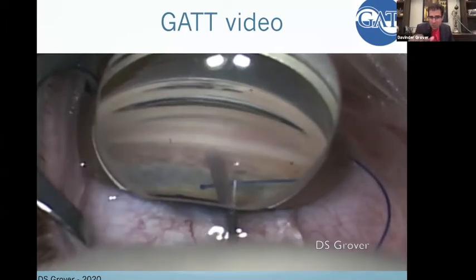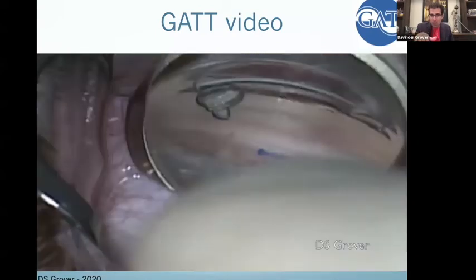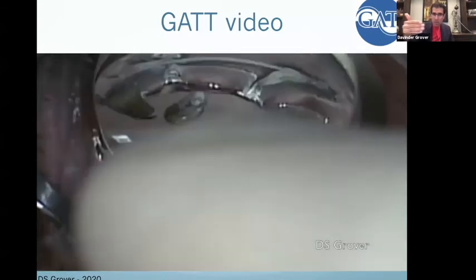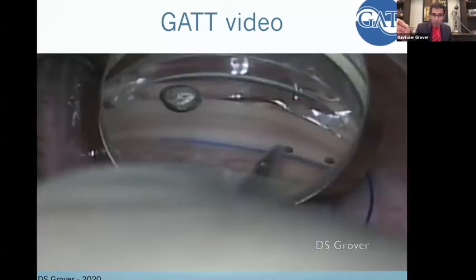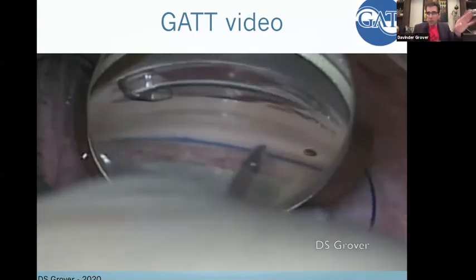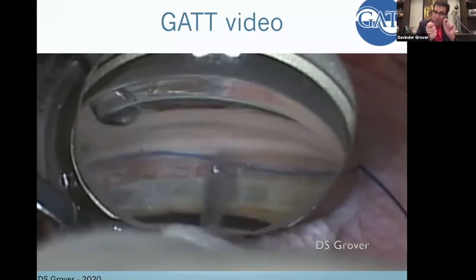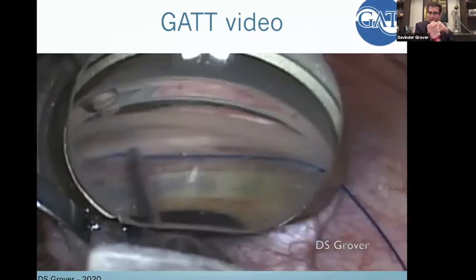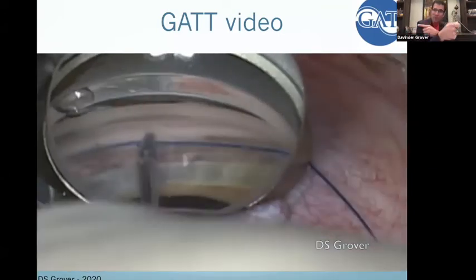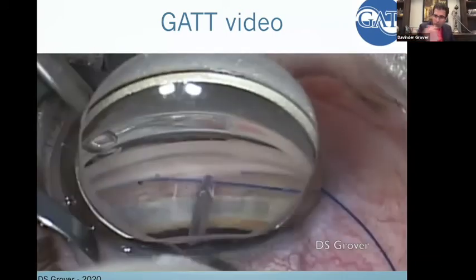And you can see I'm going to push down on the back wall so you can see the back wall of Schlemm's canal. And then I want to go as parallel as possible to the back wall. You don't want to break through. Usually after you've gone 90 degrees, you really don't have to worry about it, but now you can see it's getting harder, right? It's the feel. So I've gone about 180 degrees, and so now I'm pushing this way, and I have to get the suture this way. So you can feel that resistance until that suture comes back around, and you can just keep pushing.